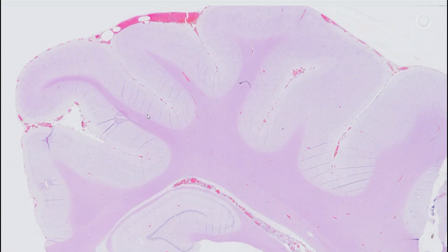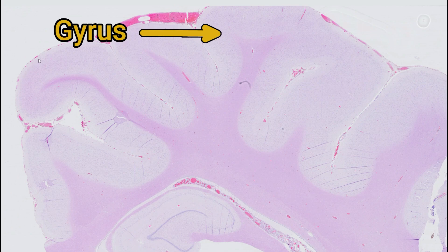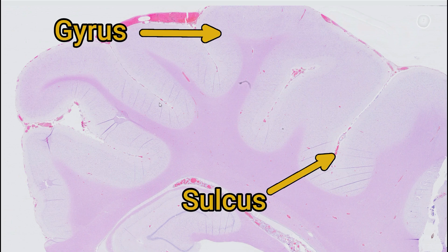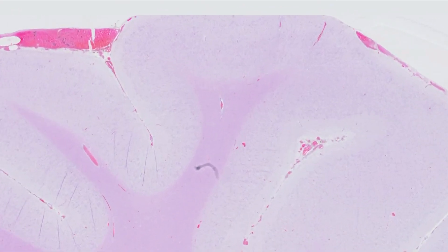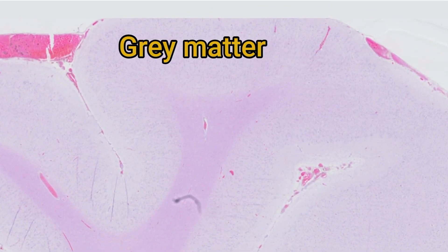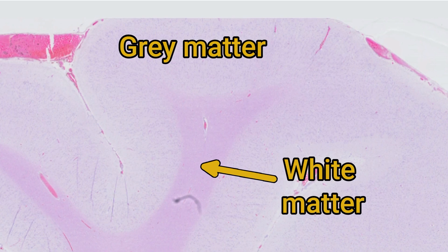This is a section of cerebrum from a calf, and at low power we can make out some anatomic features. We have the gyri, which are these wrinkly bits on the brain, and then sulci, which are the depressions or the folds. Each of these wrinkles on the brain has an external capsule of grey matter and then a central core of white matter. The grey matter looks very much more cellular - this is where all of the neurons are - and then the white matter is much more pink and dense, where all of the axons are.